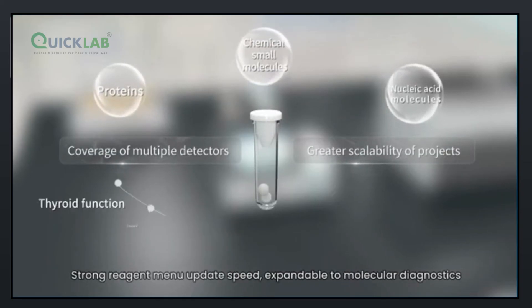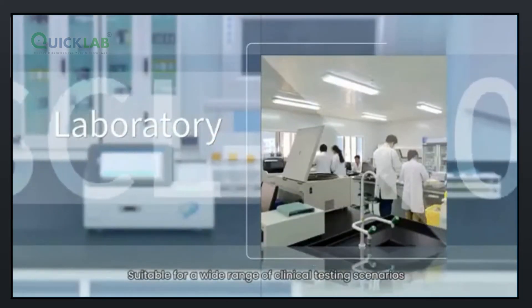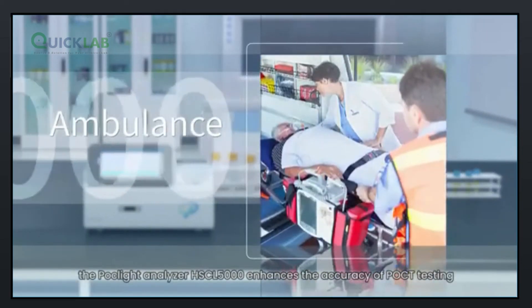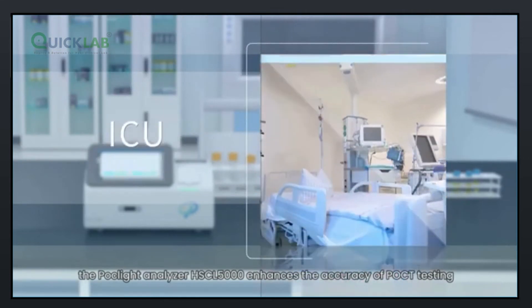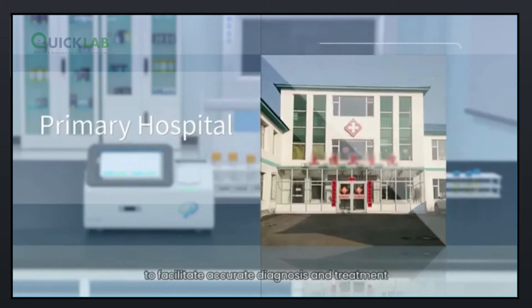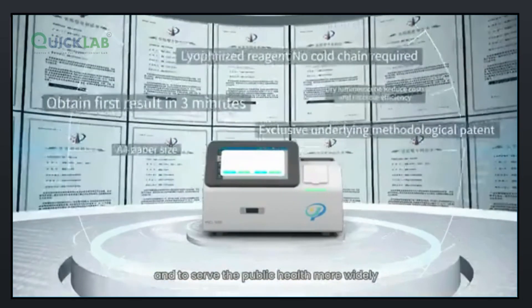The device offers strong reagent menu update speed and is expandable to molecular diagnostics, making it suitable for a wide range of clinical testing scenarios. The POC-Lite Analyzer HSCL5000 enhances the accuracy of POCT testing with dry chemiluminescence technology to facilitate accurate diagnosis and treatment, and to serve the public health more widely.